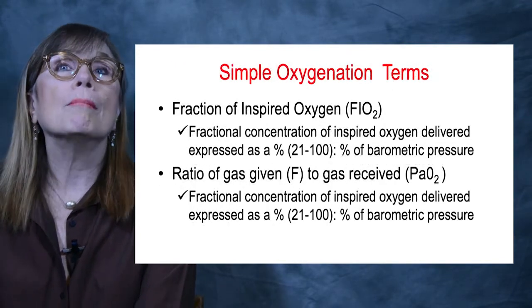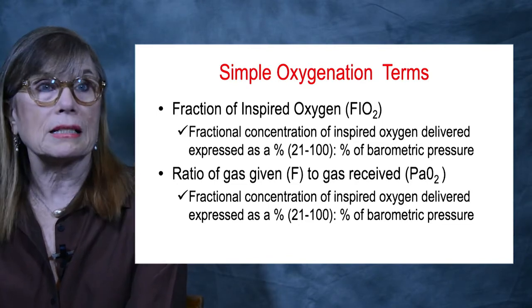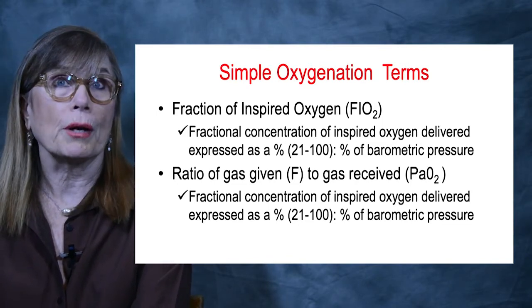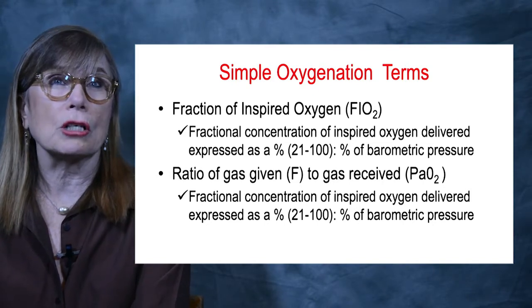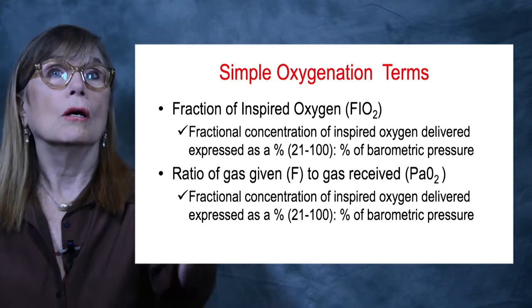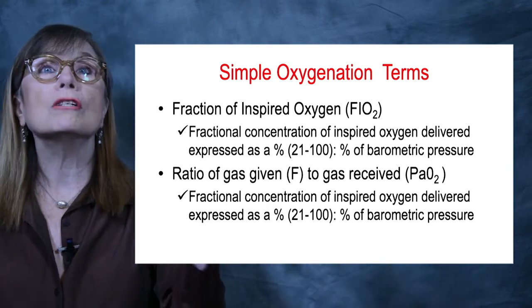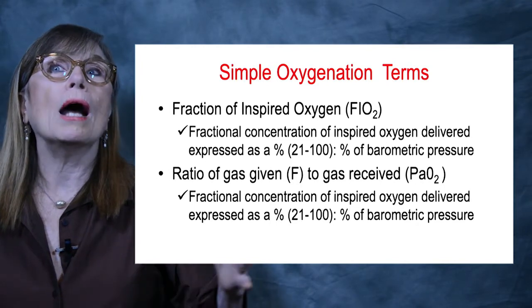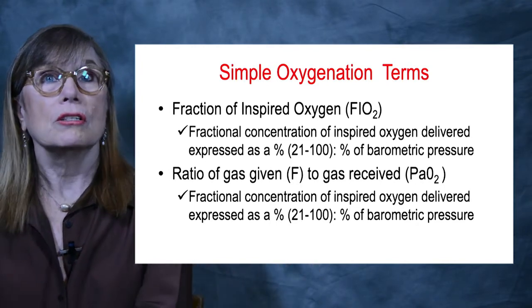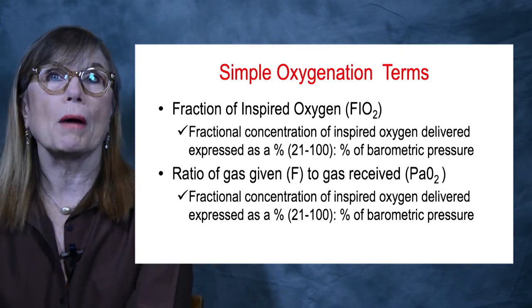Now, I want to move to something that is quite important when we're talking about blood gas evaluation in the critical care unit. First of all, we always look at oxygenation in three ways. What did you breathe? That's your FiO2. What is your saturation? That's your SaO2 or SpO2. And what is dissolved? Dissolved is what exerts partial pressure, and that's what's going to be used by the cells.